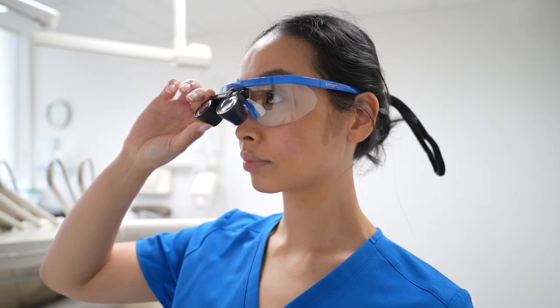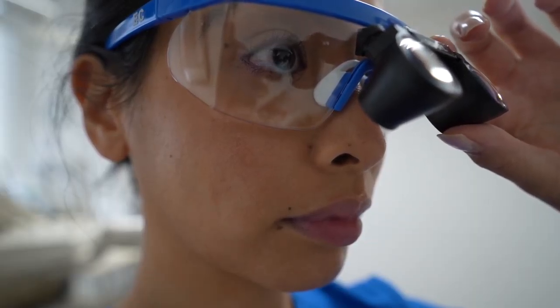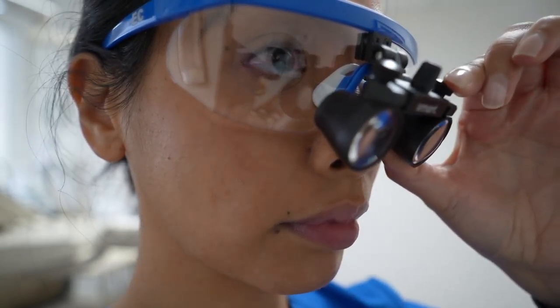It's time to set your working distance. Adjust the angled hinge so that the loop lens is as close to your frame as possible to maximize your view.